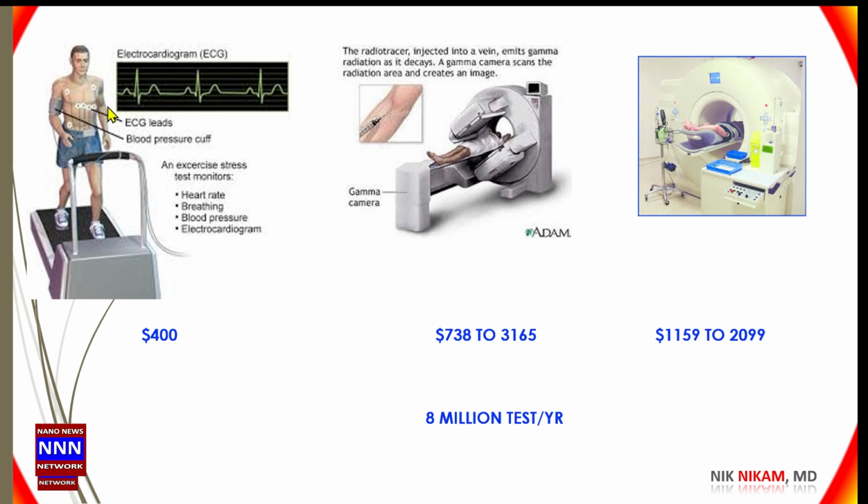A normal treadmill may cost approximately $400 depending upon where it is done. Whereas a nuclear stress can range from $738 to, I have seen, as high as $8,000. The hospitals charge a lot more and get away with it. I have no idea how they can do it. And as I told you before, 8 million nuclear stress tests are done every year. So this is one of the most commonly done tests.